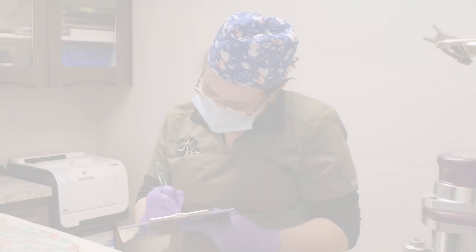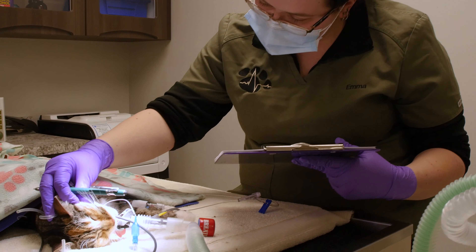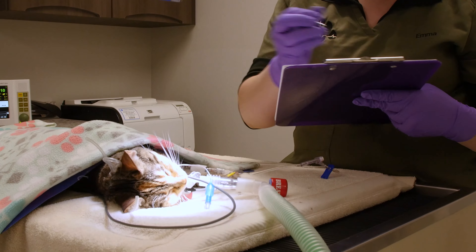Just like your dentist charts your teeth, we use a periodontal probe to measure pockets in the gums and tooth surface, checking for any root exposure. A dental chart is created to log any missing, chipped, fractured, mobile, furcations, and extracted teeth.